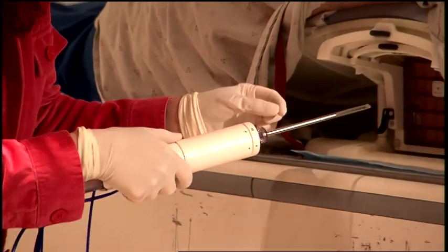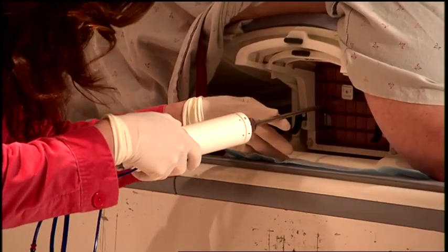Once the position is verified, small samples of breast tissue are removed using a specialized biopsy tool.